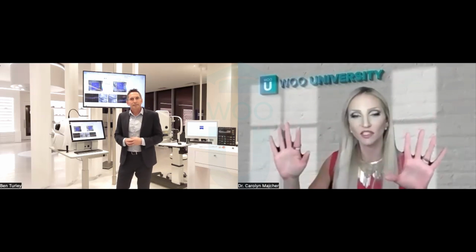Not just the numbers, but you get to actually see the graph of the trends over time. And you can visualize 3 OCT visits sequentially and scroll through them all at the same time, which is also really valuable, not only for AMD, but other diseases as well.